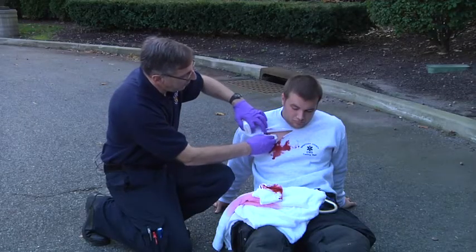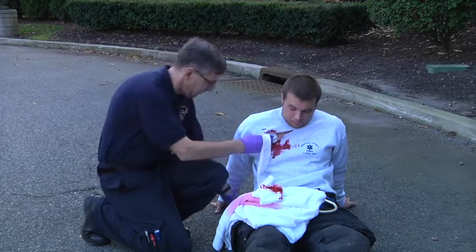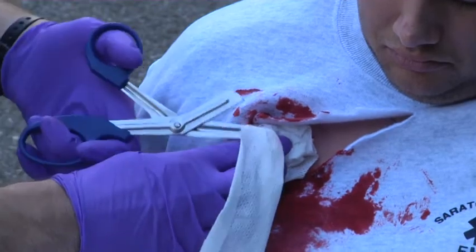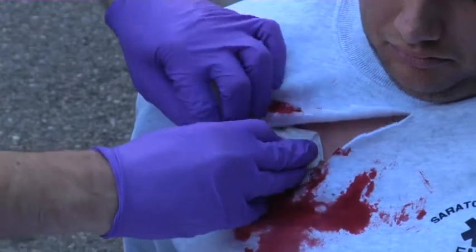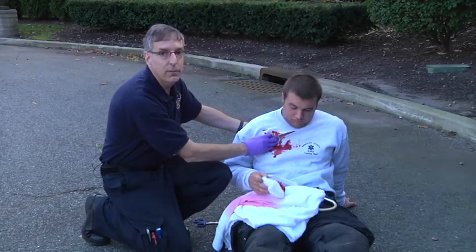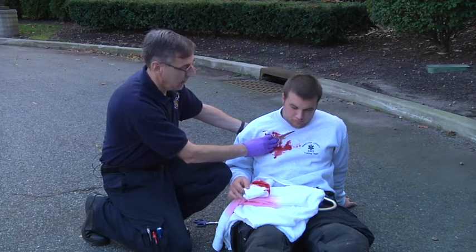Once you have enough gauze packed inside the wound, you're going to trim the gauze. Then hold direct pressure so that the gauze is inside the wound for about five minutes, just as you would with any other piece of gauze that you're packing a wound with.